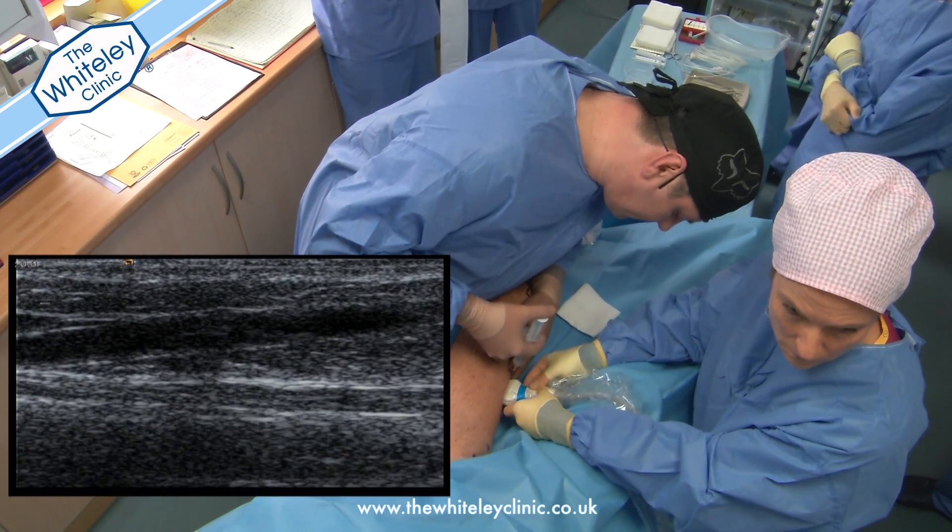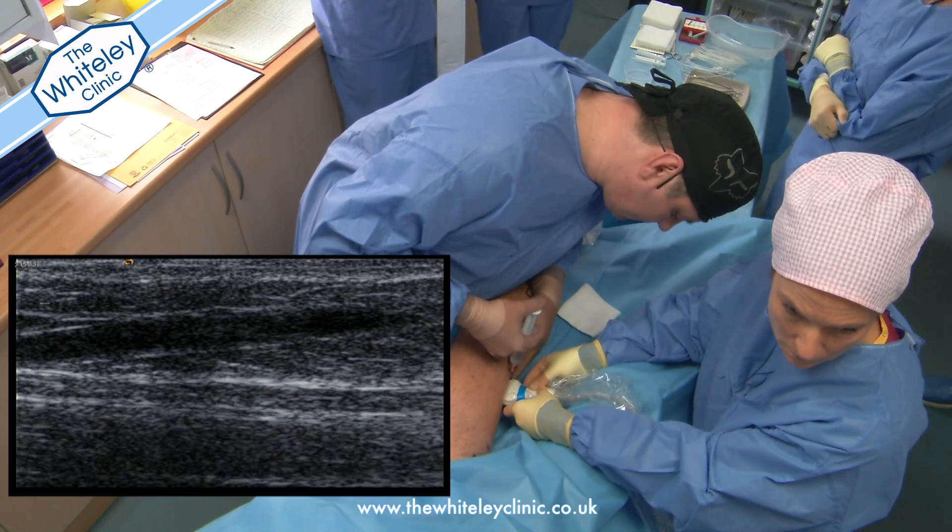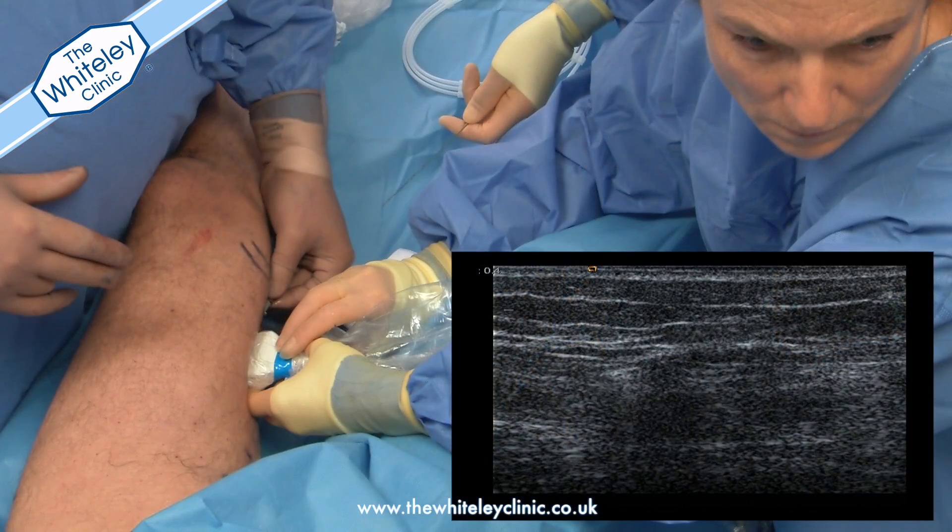This is a short video of the VenaSeal procedure being performed at the Whiteley Clinic. The VenaSeal is also known as the superglue procedure for varicose veins.